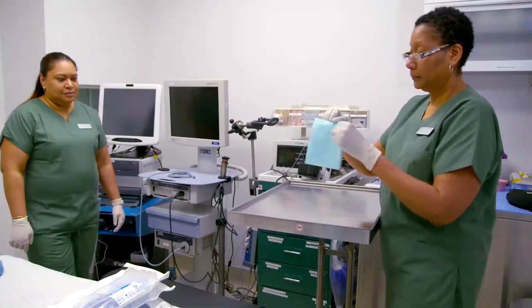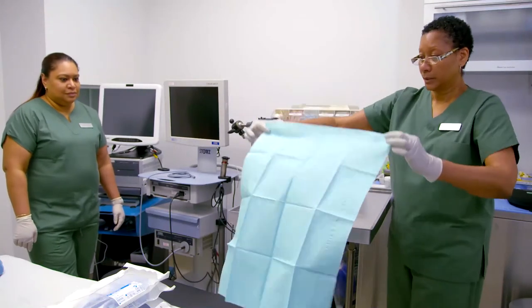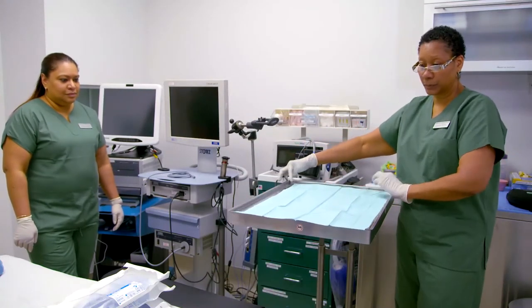Having a staff that has a lot of experience, which I do, with balloon dilation surgery, they were very quickly easy to learn how to use the new technology and set it up, making it easy for me and easy for them. So my first setup for the procedure would be a non-fenestrated drape. Just hold the rear edge and I just pull over.